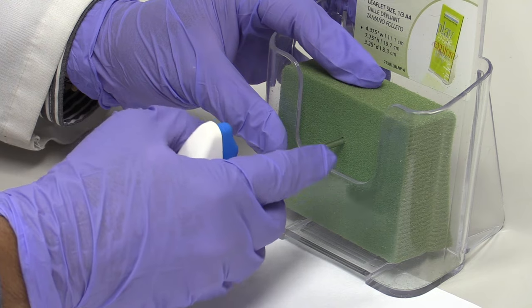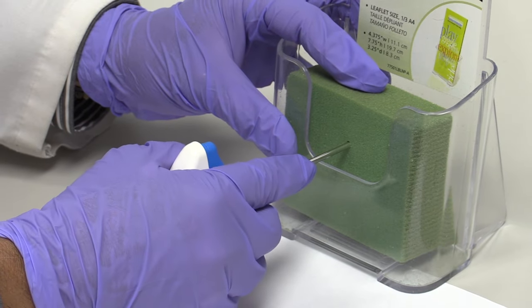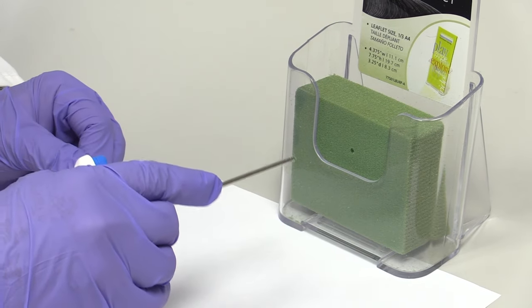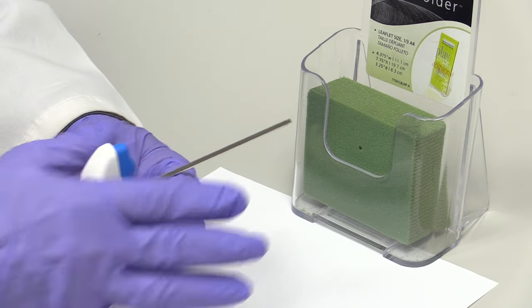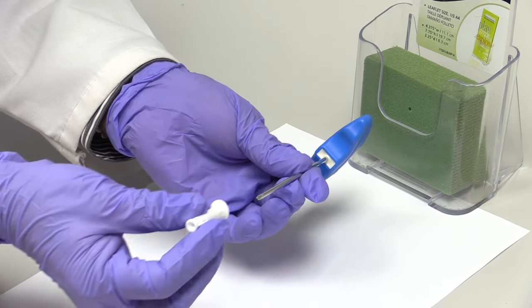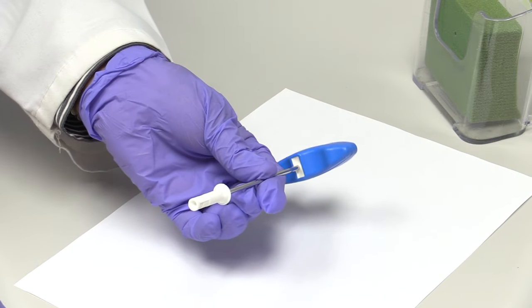Withdraw the needle with a straight pull and gentle alternating rotary motion. No rocking, sculling, or gyratory motion is needed. Once the needle is withdrawn from the patient's body, remove the white cap. Then, attach the insertion aid to the distal cutting end of the needle and remove the biopsy specimen contained within the lumen of the needle.